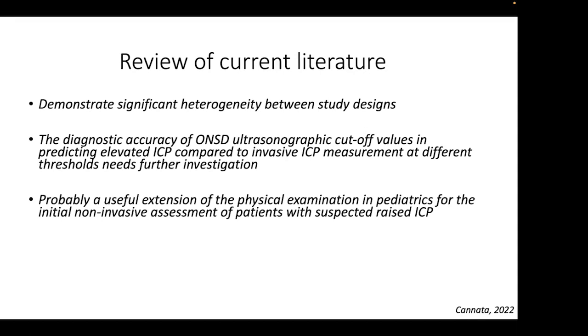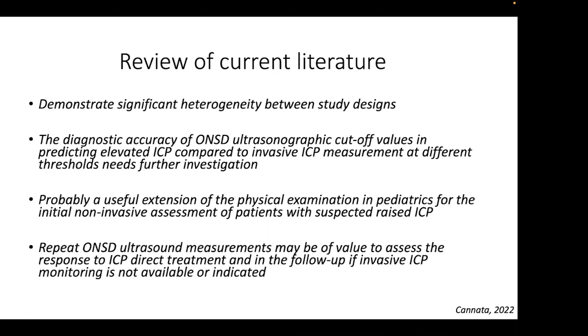Though it is probably a useful extension of the physical examination in children as an initial non-invasive assessment of patients who are at risk of or suspected of having increased intracranial pressure. And repeated optic nerve sheath diameter ultrasound assessments may be of value in assessing response to ICP-directed treatments and follow-up of patients when invasive ICP monitoring is not available.